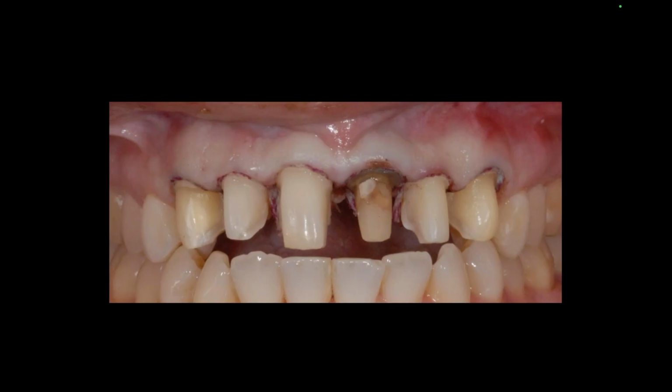So I know at the end, I mean, this root is dark. We could have internally bleached it. It's a whole other conversation for a different day. But the bottom line is I know we're going to have gray shadowing here. So I need the most opacity I can get in this area and still allow me to have some sort of translucency that makes the teeth look real.